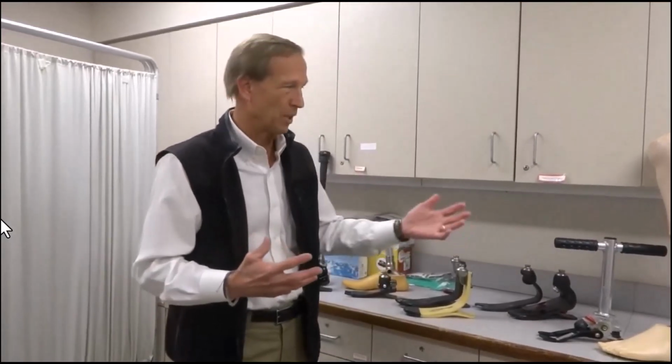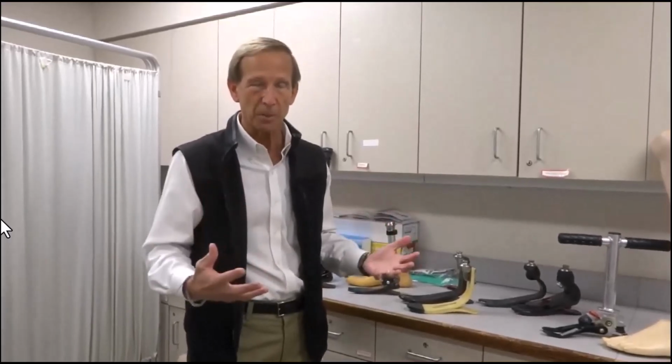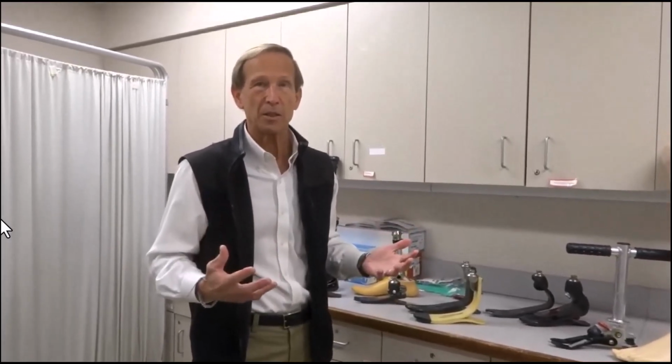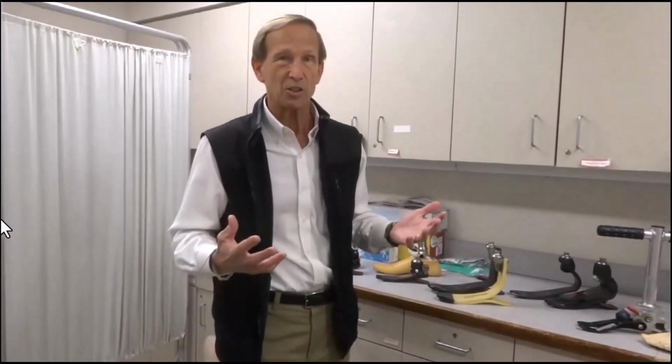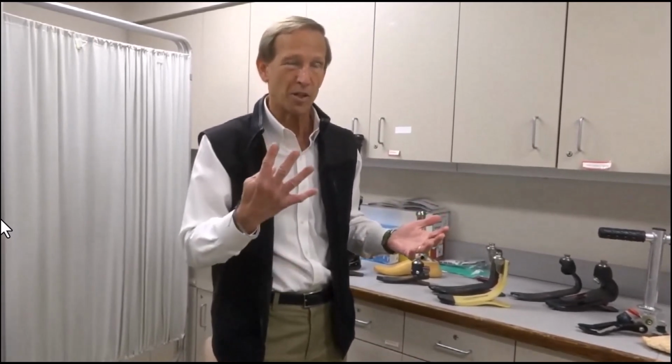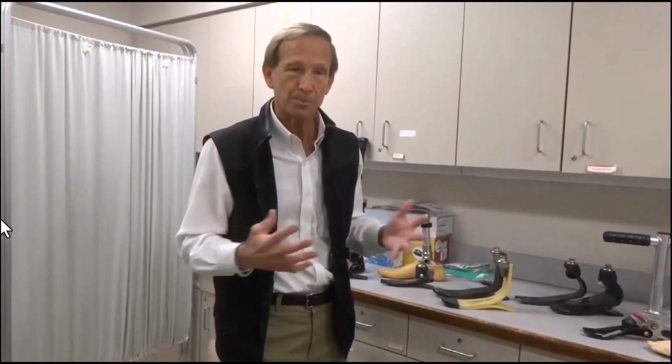Almost anybody can walk on any foot, but to really optimize or maximize your function, we want to select the right foot. The challenge is there are 220 different prosthetic feet out there on the world market, and we have access to most of them. They are generally categorized into 4 different classifications, and that classification was established by Medicare 25 years ago.